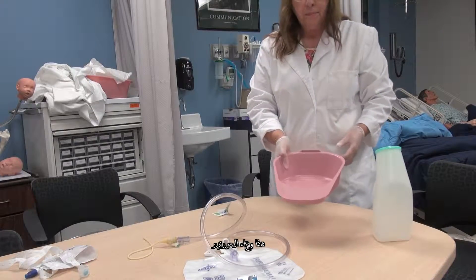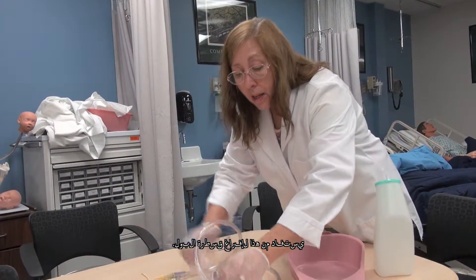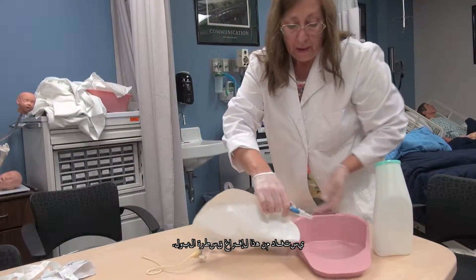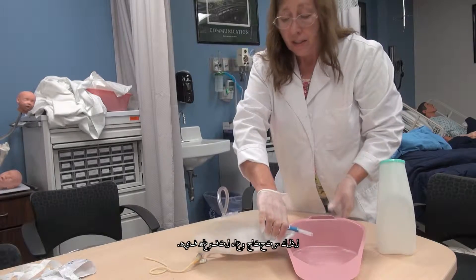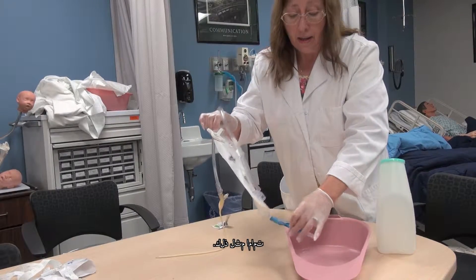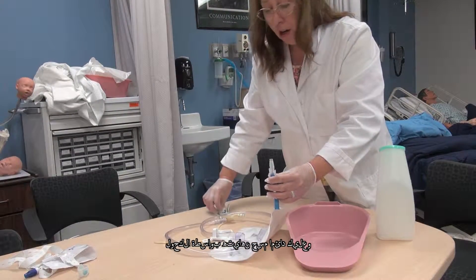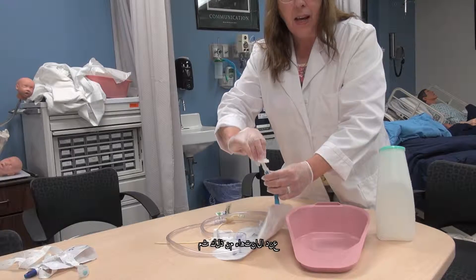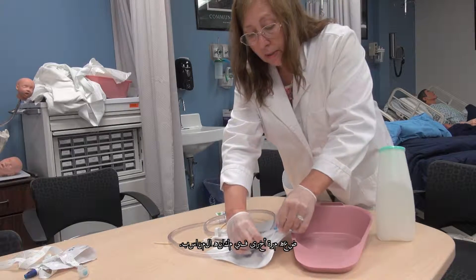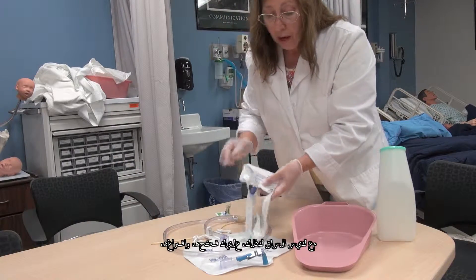This is a bedpan. Utilize that to empty the catheter of the urine. You'll need a vessel to empty it in. Just like that. And you would always wipe off the end of this with alcohol when you're done with that, and put it back into its pointed place. With a leg bag as well.